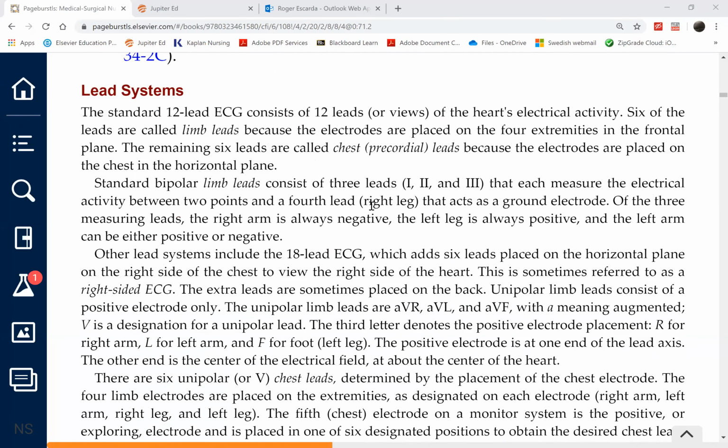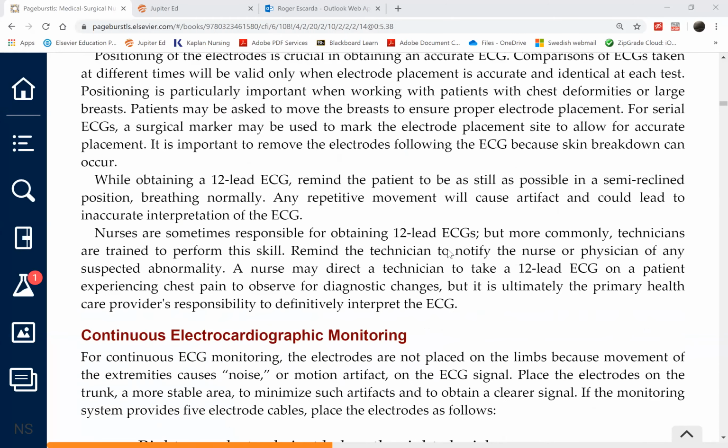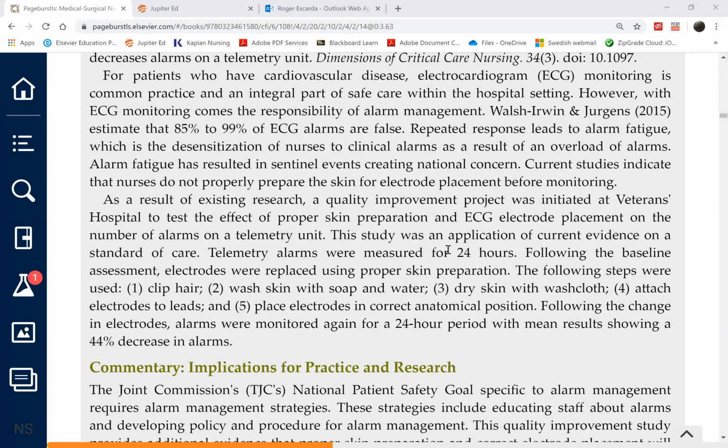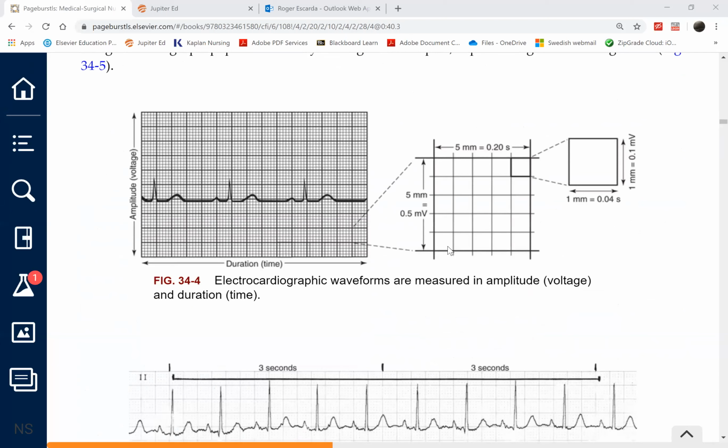I won't discuss the entire 12 lead EKG system, I mean, it'll take us a long time. I'll go straight to what an EKG paper shows. And then after I explain this, we'll take a break because we're out of time anyway.